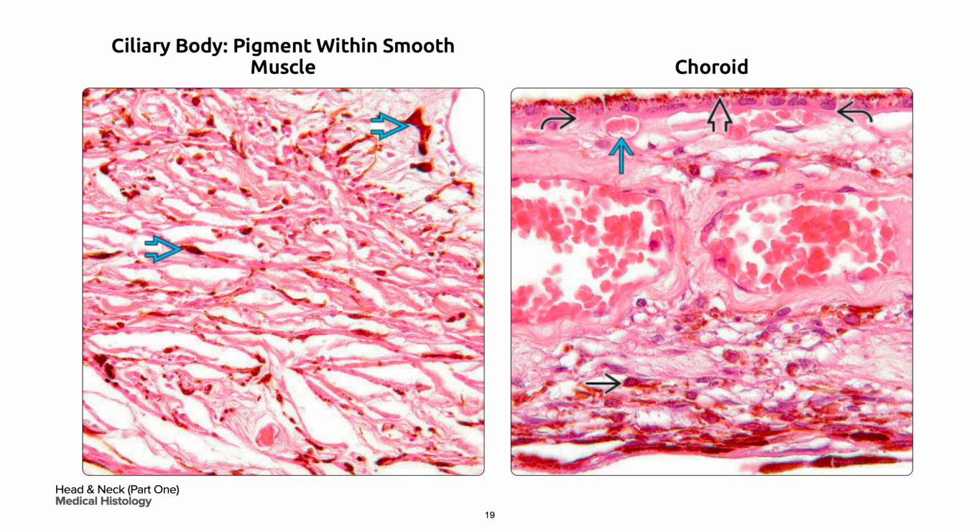On your right is the choroid, which begins posterior to the ciliary body and terminates at the optic nerve. It lies between the retina and the sclera. The choroid is composed of vessels with interspersed melanocytes in black single arrow and fibroblasts. Bruch membrane in curved black arrow is the basement membrane for both the choriocapillaries in single blue arrow and pigmented retinal epithelium.